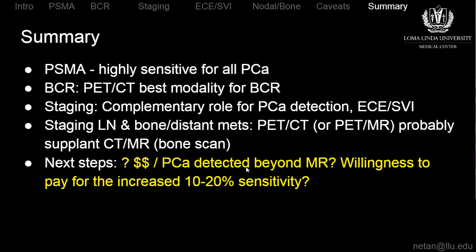So in conclusion, we're probably not ready for PET MR for screening prostate cancer or even initial evaluation in the setting of initial diagnosis. However, in challenging cases, PET MR can have a very complementary role to really identify these lesions that are missed by MRI in the setting of continued suspicion. However, in the setting of biochemical recurrence, PSMA PET-CT has a very important role and will probably supplant current imaging guidelines, including fluciclovine as the primary study of choice.